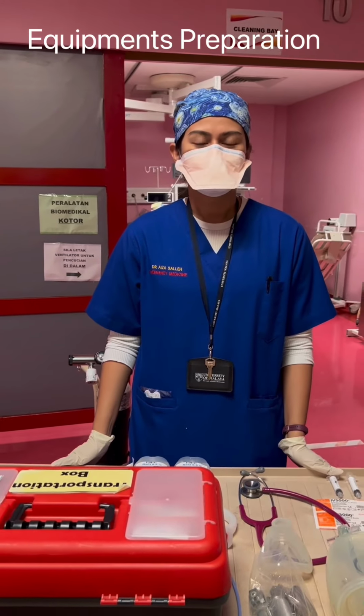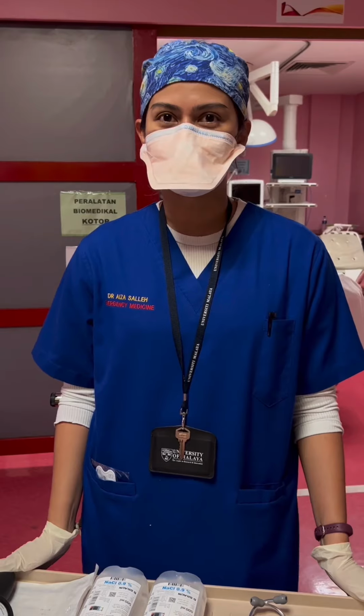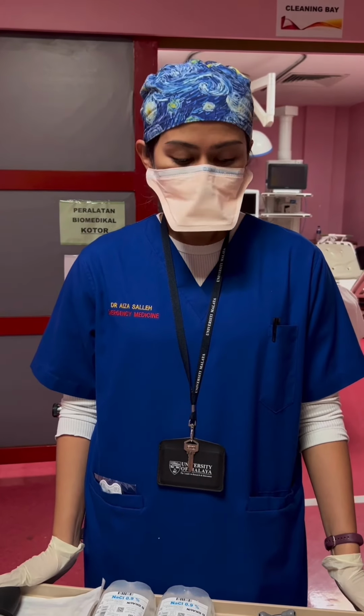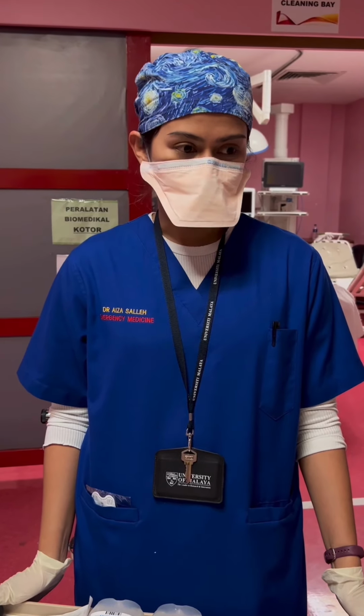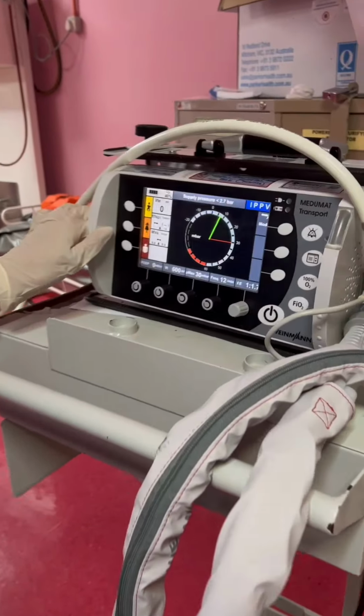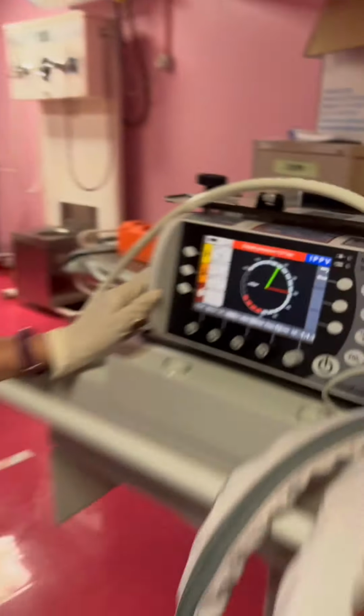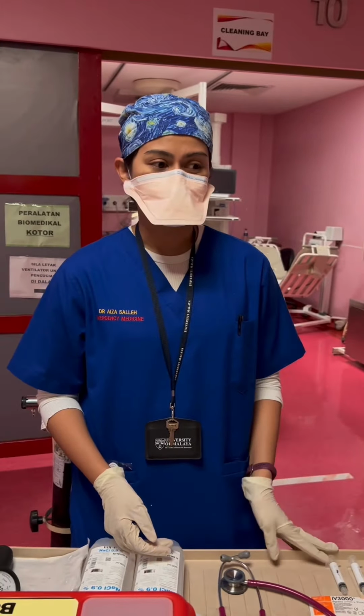This is a video simulation on intra-hospital transfer of a critically ill patient. First, we will prepare the equipment. We have to ensure that we have a ventilator with a full battery charge and the settings of the ventilator as per the patient's condition.